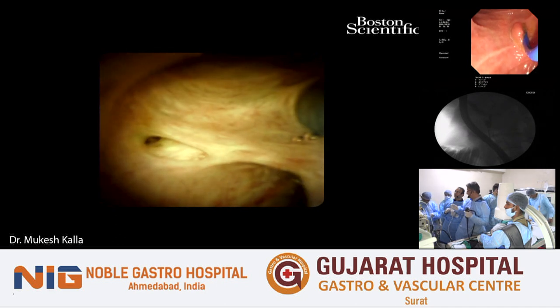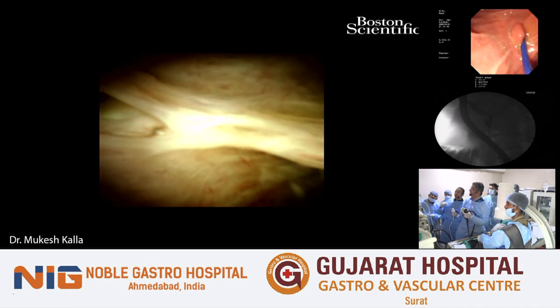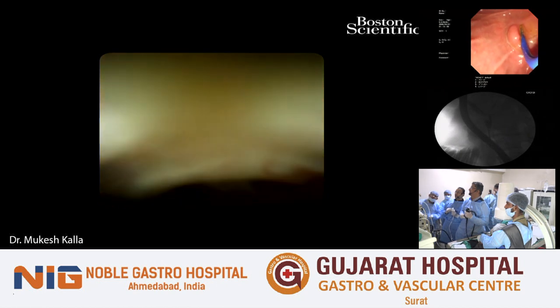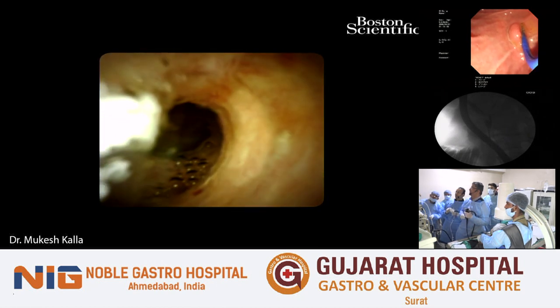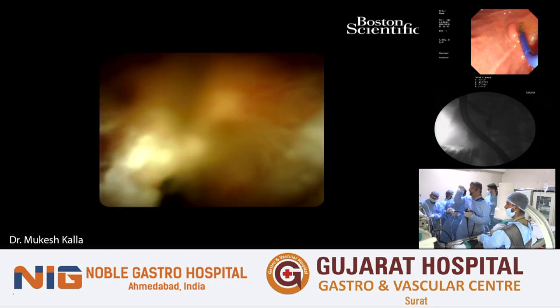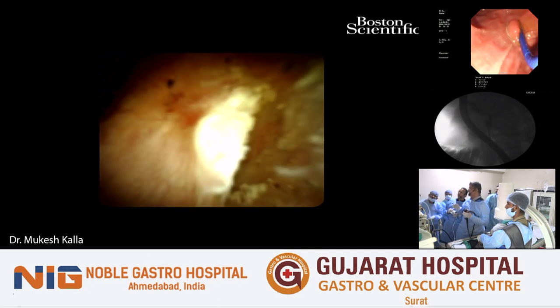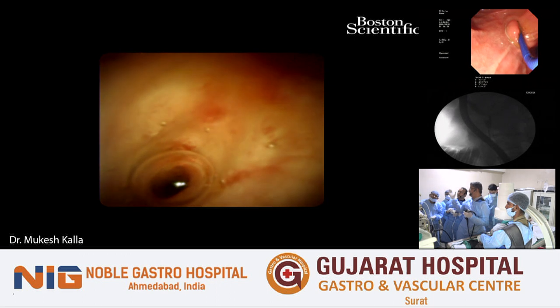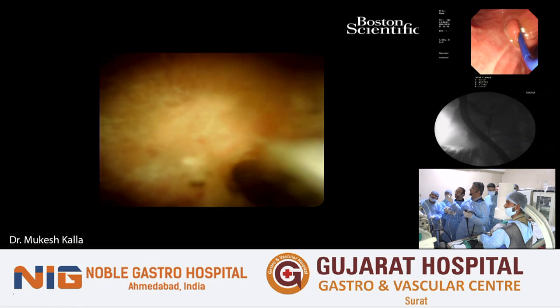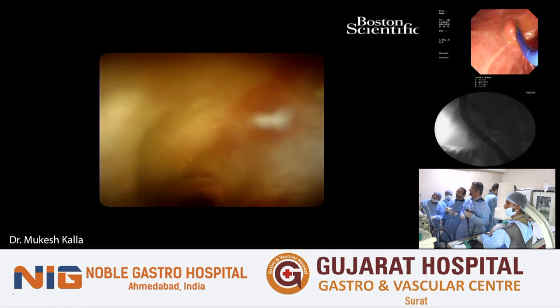Let's go in and see. I think this may be a second generation duct. Come to the middle. This is the common bile duct. Stay in the middle. Now this is the cystic duct CBD junction. On the right side you saw the cystic duct opening, the small stone which was floating in and out of the cystic duct, and on the left side was the plain lumen of the common bile duct.